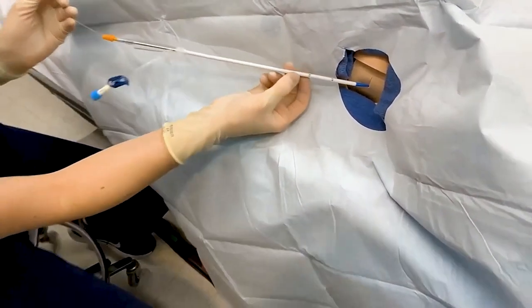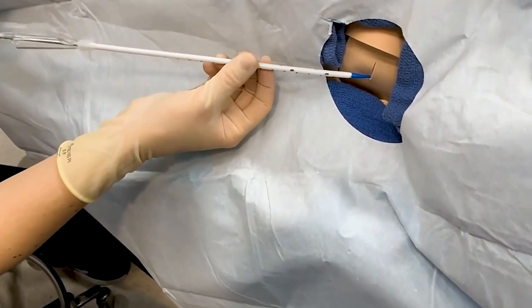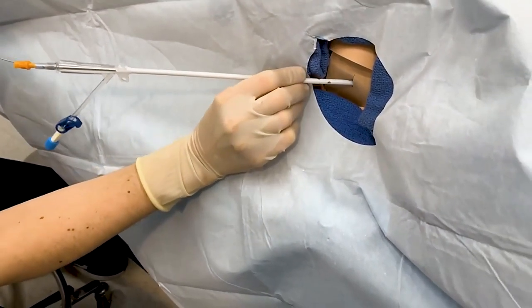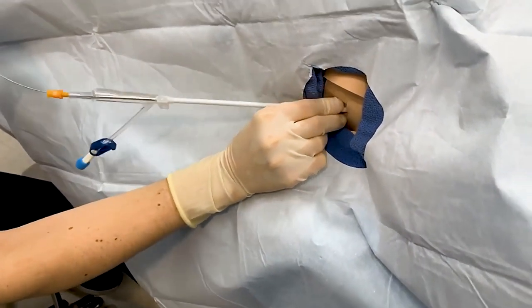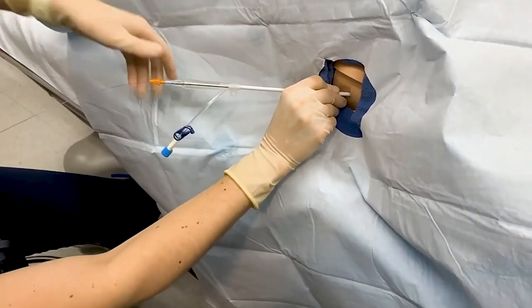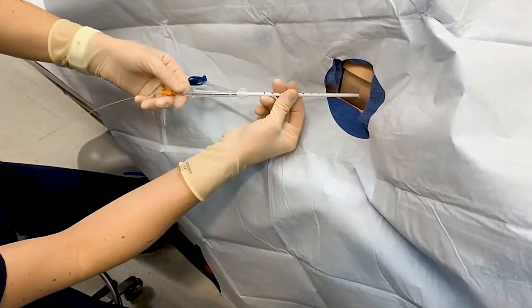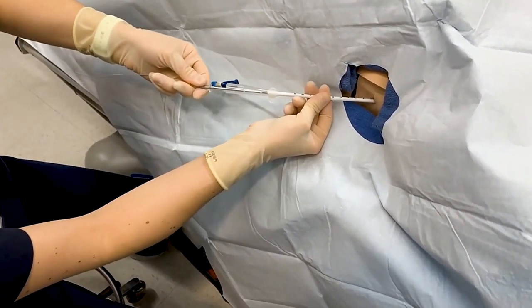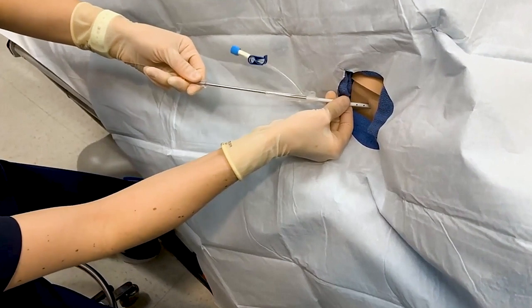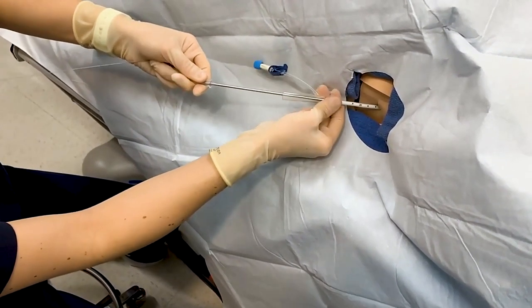You can see that you have the holes on the distal tip of your pigtail, just like you would with a chest tube, so you want to make sure that you're getting all of those into the thorax. Go ahead and advance your catheter. Once you are in the thorax, advance your catheter and hold your Trocar stable.